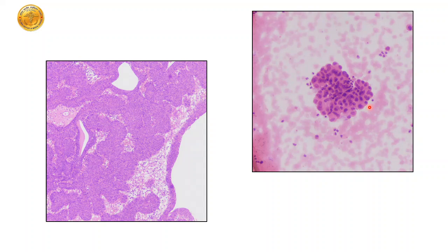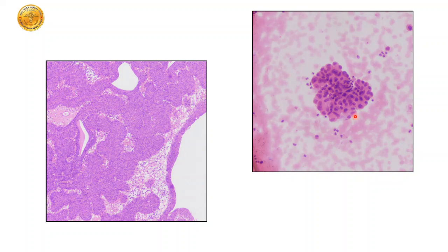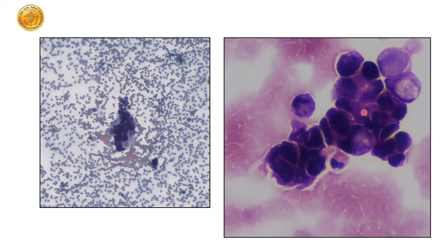On histopathology we had very well-oriented cells, not very markedly dysplastic looking, but going quite deep into the lamina maintaining its attachment with the urothelium above. This is the urothelium, this is the edematous lamina propria, and a tumor actually going quite deep into the lamina propria. This is what we under-called on cytology because we didn't see any fibrovascular cores and didn't see much hyperplasia, which is also seen in the corresponding histopathology section.